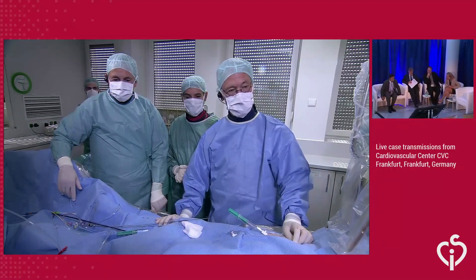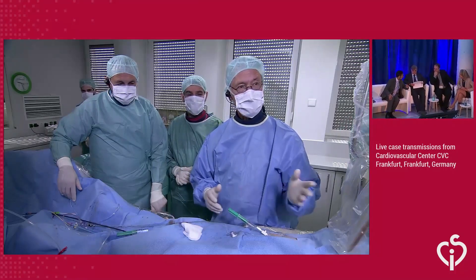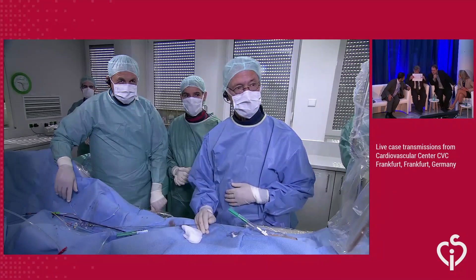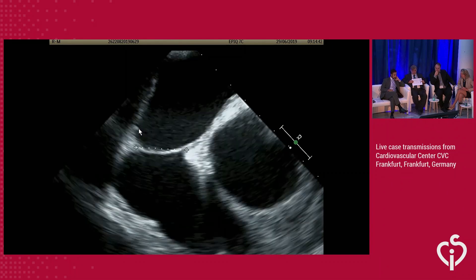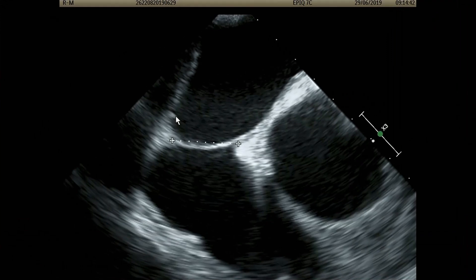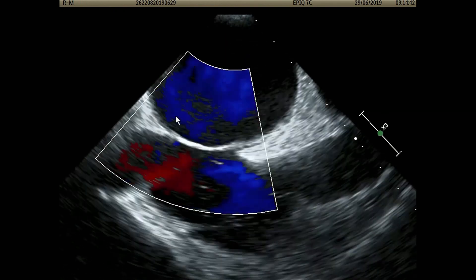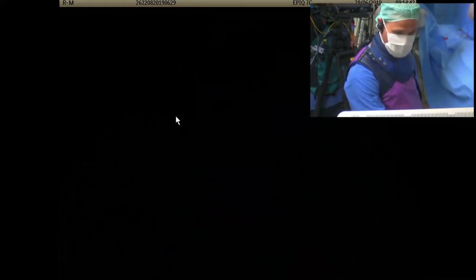Welcome back. The TE probe is in. We did the measurements required for the trial and Martin will go over the anatomy on TEE. We briefly did some measurements on the septum. In the four-chamber view there's quite a lot of space - 24 millimeters. The short axis at the base is also 24-25, and in the bicaval view also 25. The thickness is not more than one to two millimeters, so there are no signs of thrombus, no ASD. The anatomy of the septum is perfect for the device.